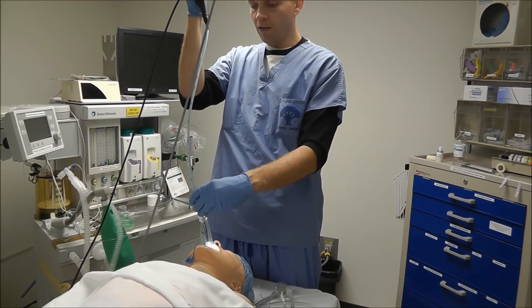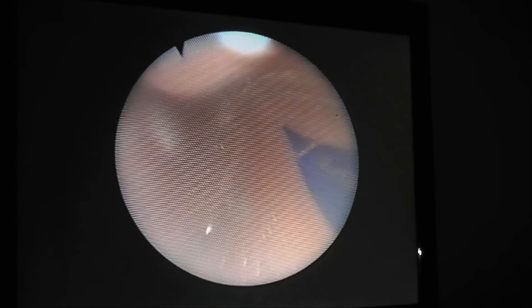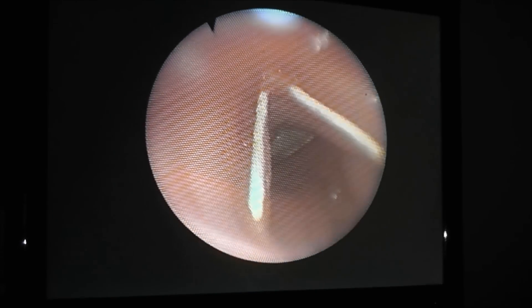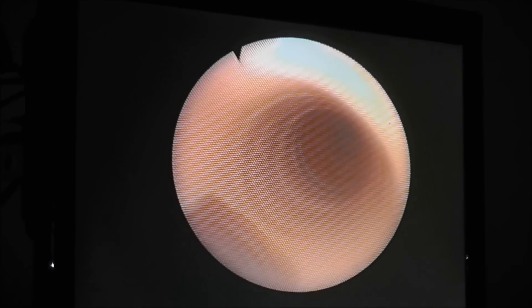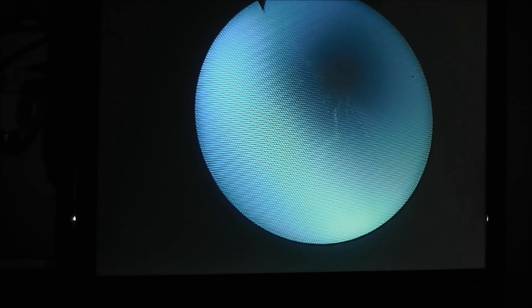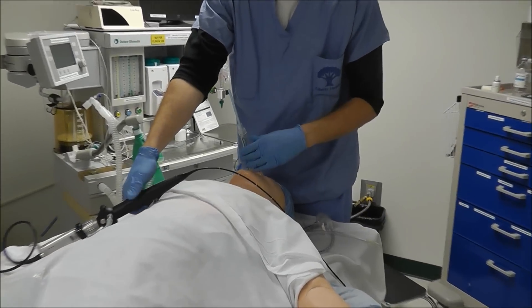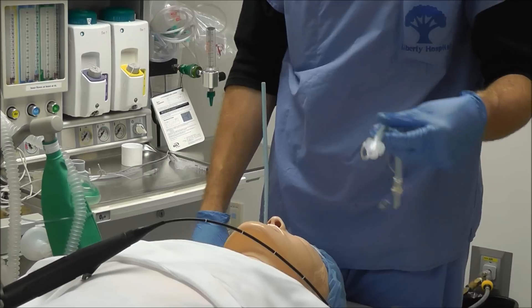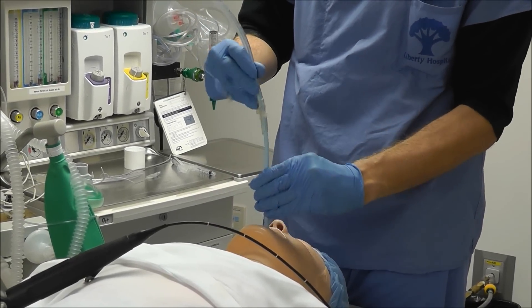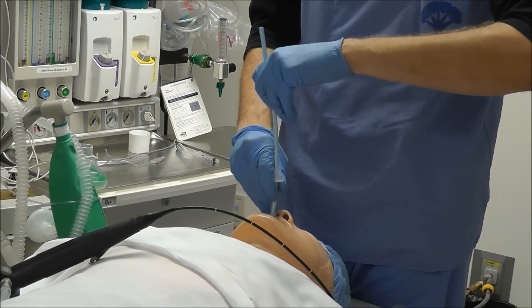We go ahead and advance this scope into the trachea. Then I go ahead and advance this fiber optic scope down the LMA and into the vocal cords. Now I slide my blue tube exchanger into the trachea and pull out my fiber optic scope. The great thing about this method is it allows me to take out my LMA, and now I can slide an endotracheal tube over this tube exchanger and into the trachea.